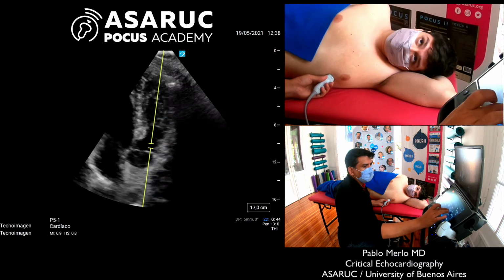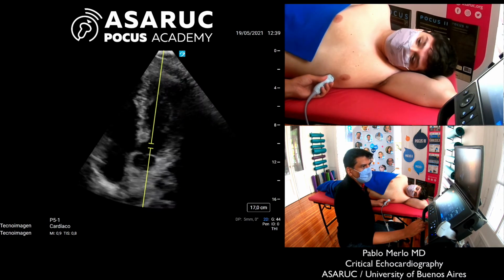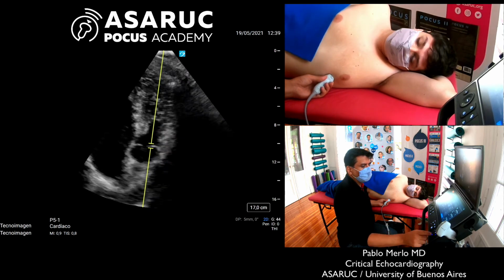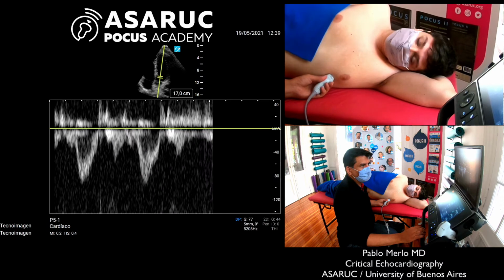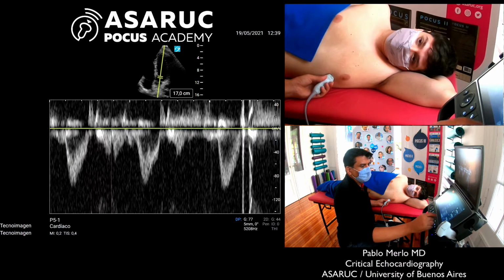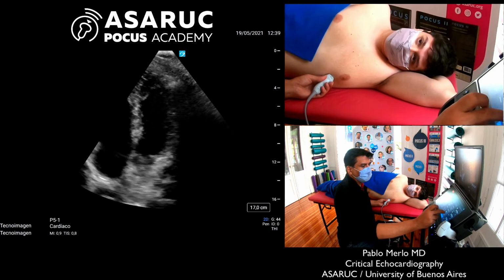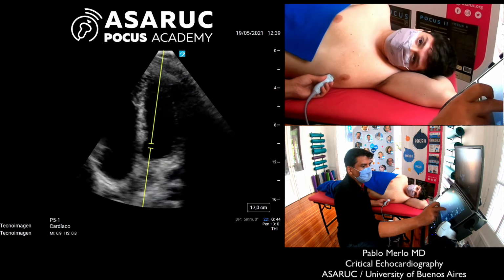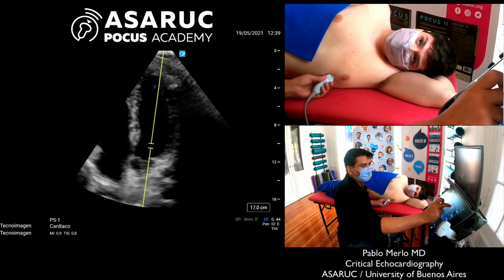If we calculate aortic VTI manually, it should be noted that it is necessary to take between 3 and 5 measurements to get a mean value, which reduces the inter-observer variability of the measurement.